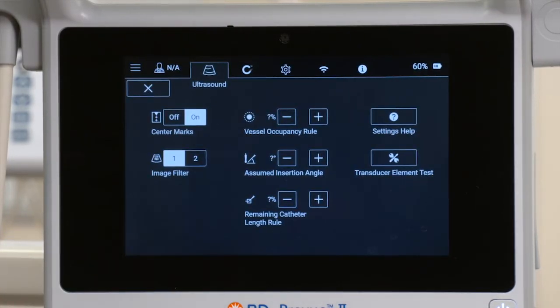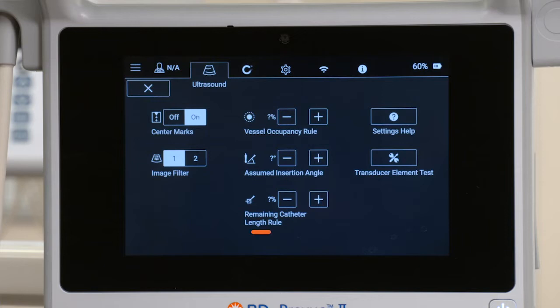As you assess vessels, refer to the following settings: vessel occupancy, assumed insertion angle, and remaining catheter length.